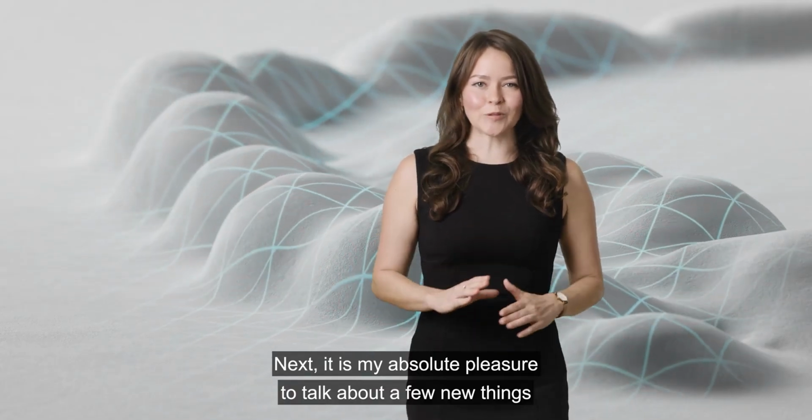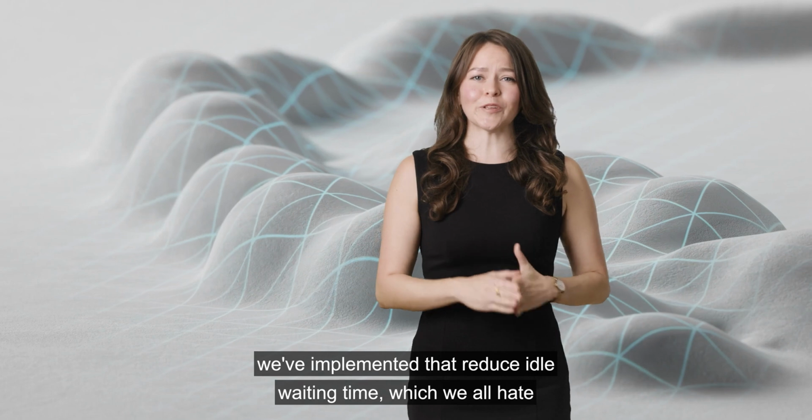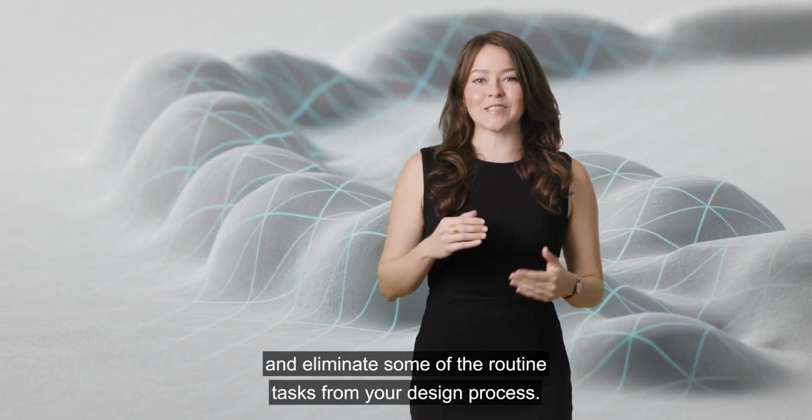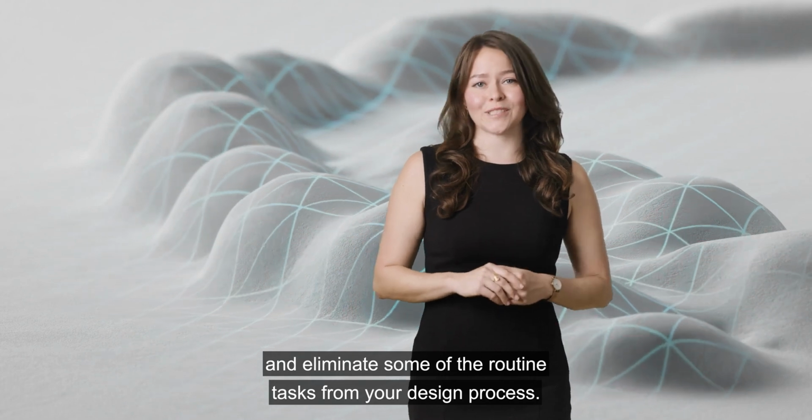Next, it is my absolute pleasure to talk about a few new things we've implemented that reduce idle waiting time, which we all hate, and eliminate some of the routine tasks from your design process.